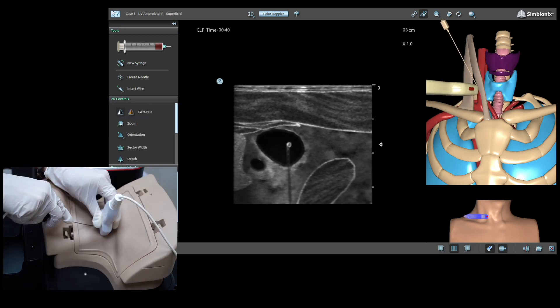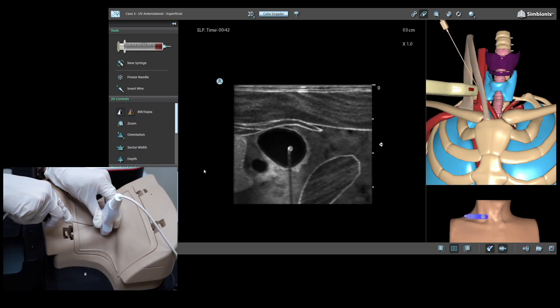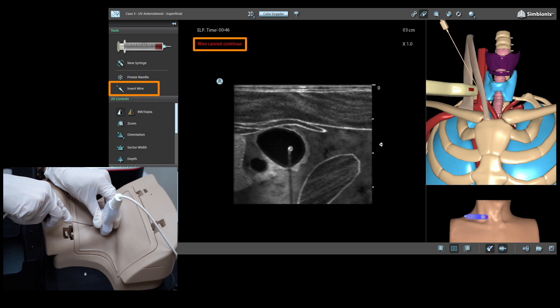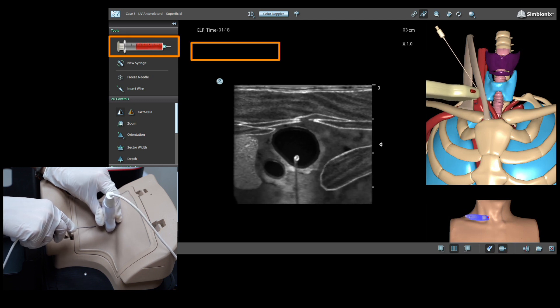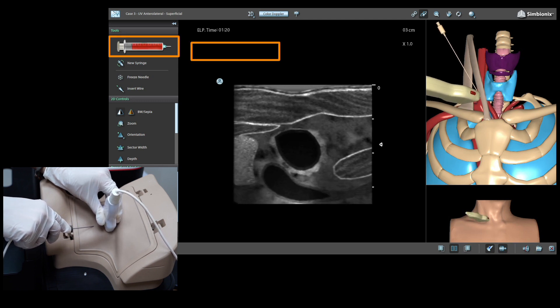Posterior wall puncture of the vein will not allow wire insertion. Accidental puncture of the artery will induce a syringe filling with bright blood and a warning will appear.